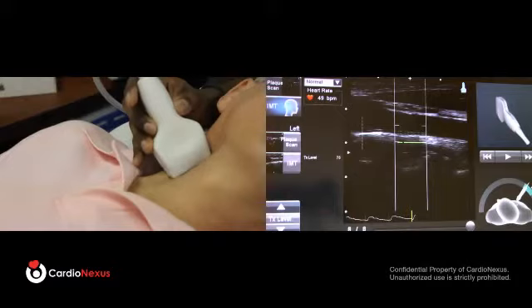So now I'll run my 2 checks again. Is the angle in the correct region? In this case, yes it is. And now, is that dotted line in the widest part of the artery? In this case, yes it is.